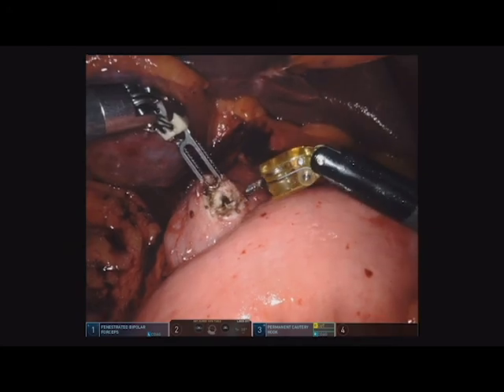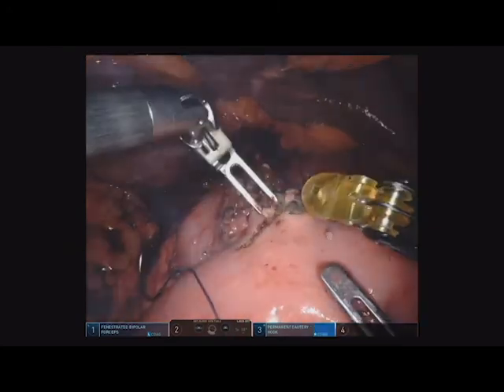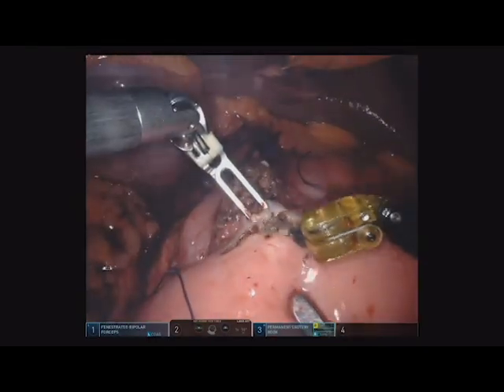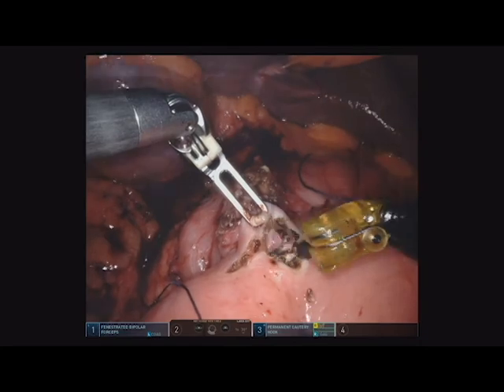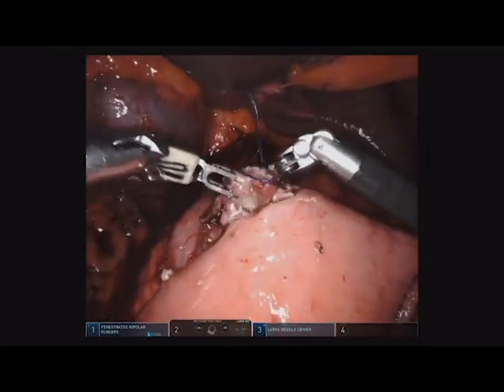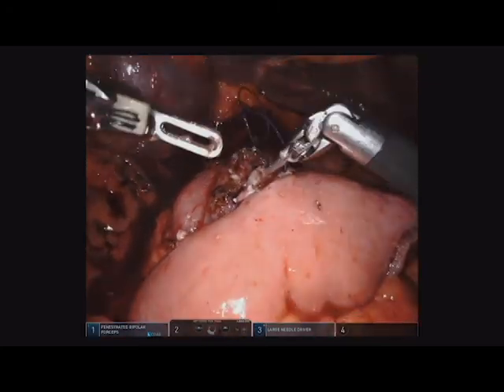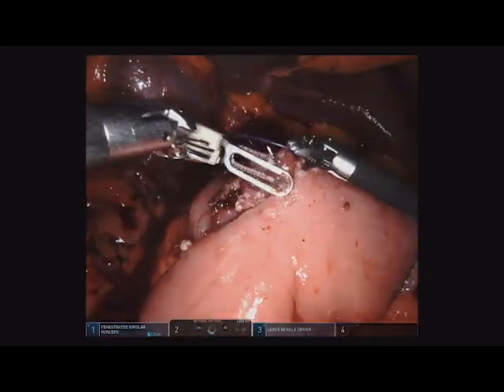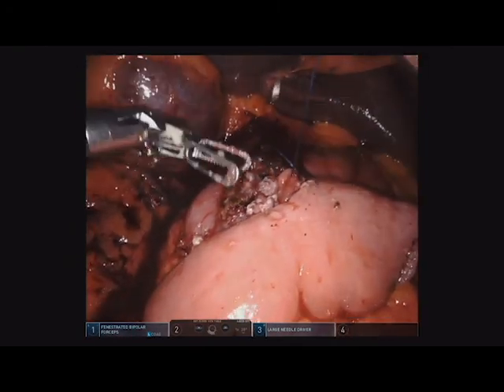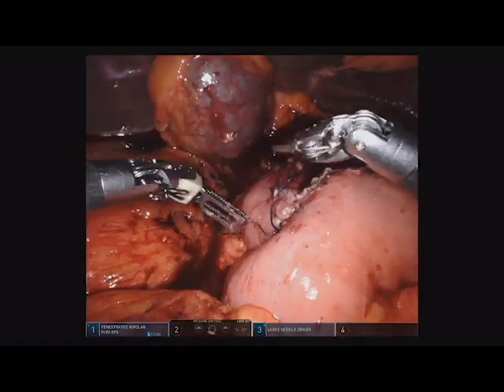Hook cautery from the robot is used to create an enterotomy, and these are kept even, keeping in mind that both the dilated duodenum as well as the jejunum have a tendency to expand with further tension. The four-zero Vicryl stitch is then used to create a continuous anastomosis. The back wall is stitched first, making sure that mucosa is grabbed with every bite, and subsequently the anterior wall is stitched, grabbing bites of mucosa but also ensuring that the mucosa is inverted.